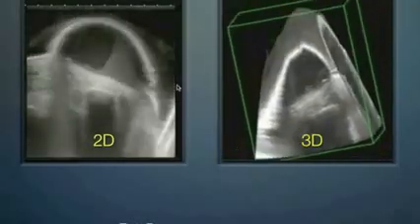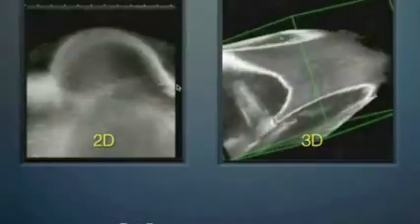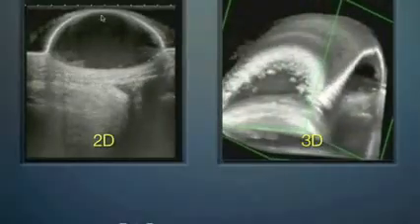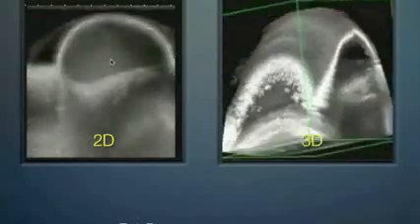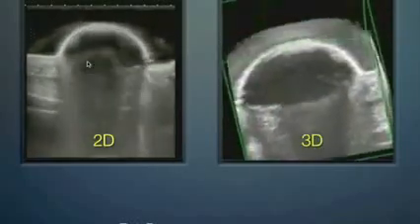And this is an example of somebody who has a large hemorrhagic bullae on their foot that was dunked in a water bath mixture. And this is the 2D image of that structure here. We're fanning through that. All this meniscus that you see there, that's all the hemorrhagic material. We get very good visualization in the 2-dimensional mode.